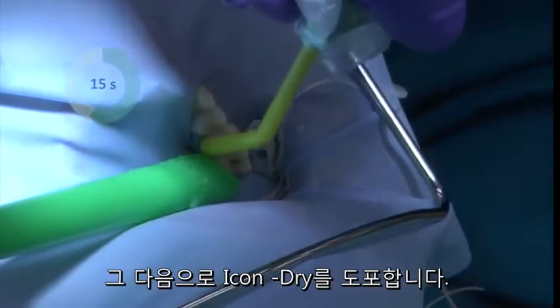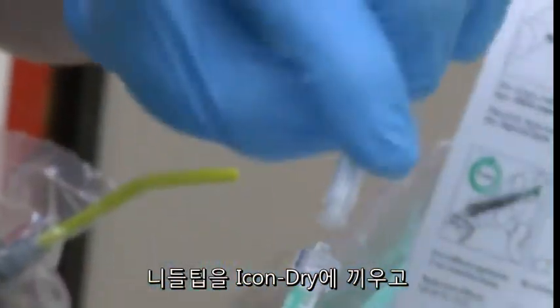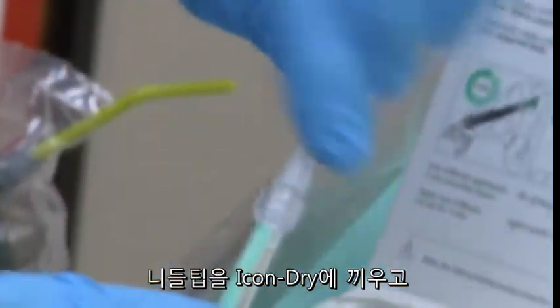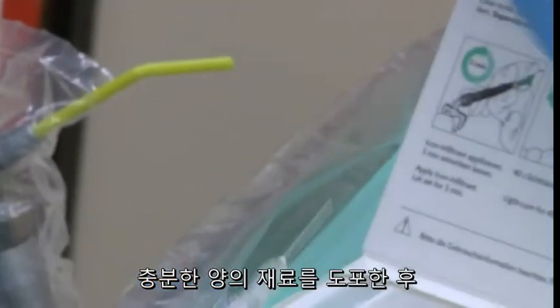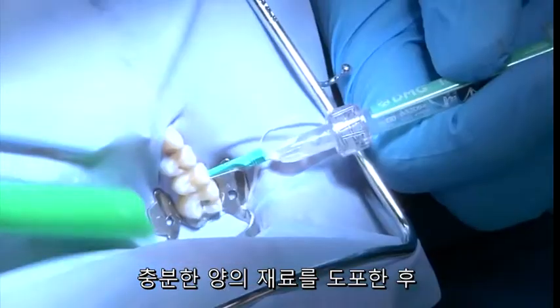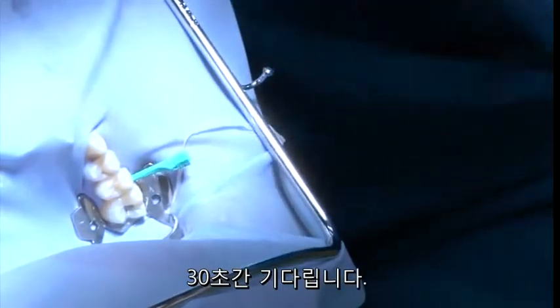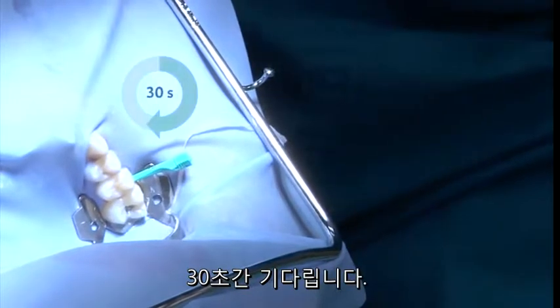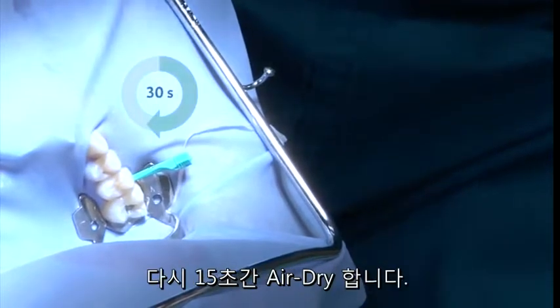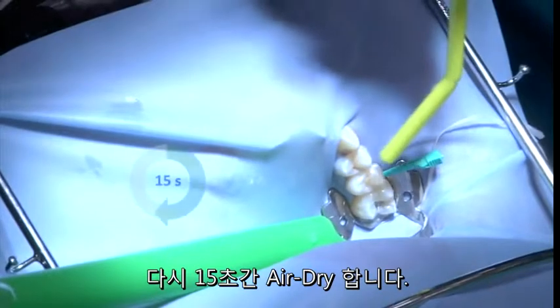Next, the Icon dry is applied. Attach the needle applicator to the Icon dry syringe and extrude an ample amount of ethanol onto the lesion site. Then let it sit for 30 seconds, followed by drying with oil-free and water-free air for 15 seconds.